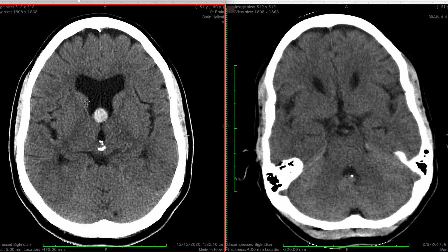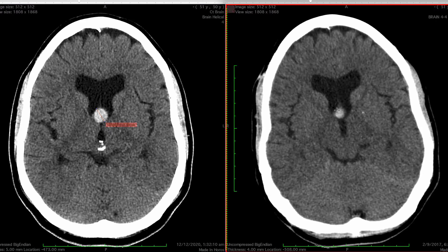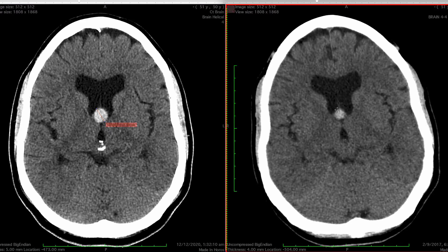We can measure the size of the growth: 12 mm compared with the previous measurement of 8.5 mm. We can say that there has been growth.